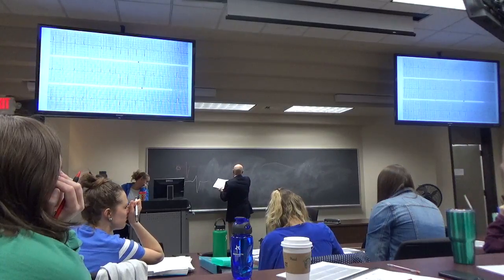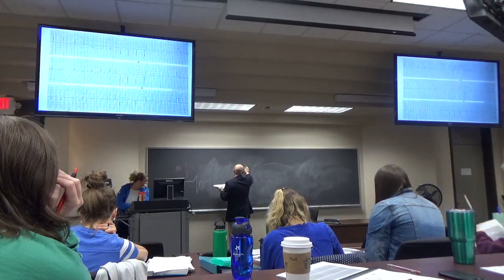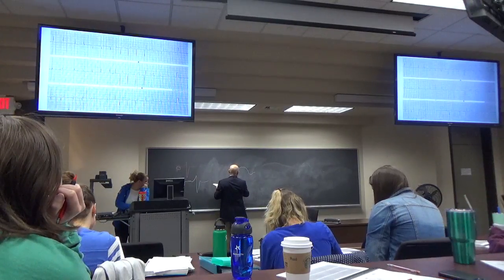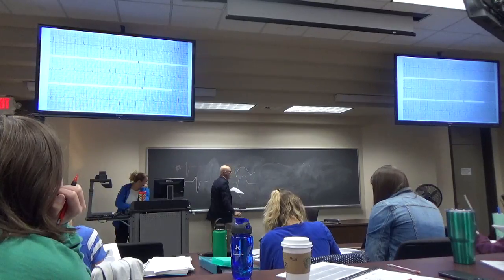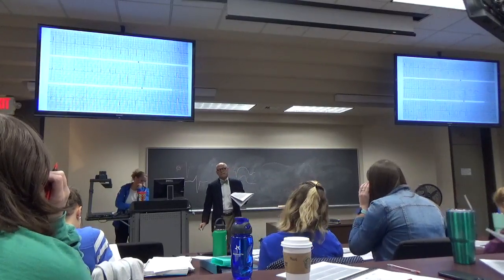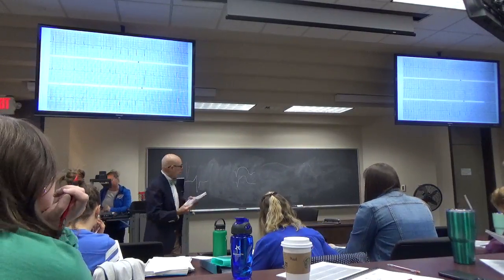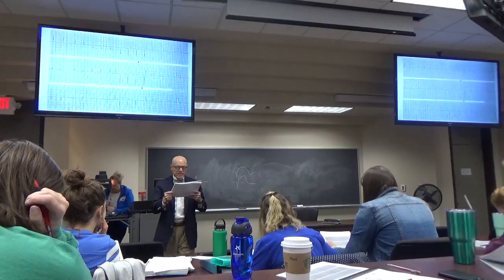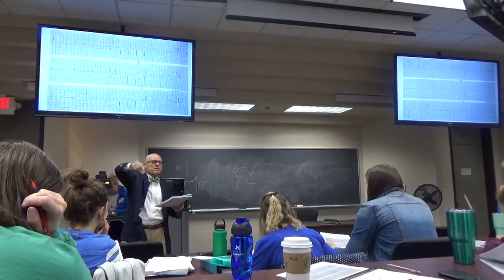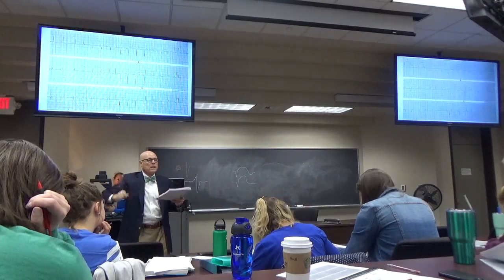So what I said initially was that this is an acute MI, right? Many authors will tell you now that that's an acute MI as well, because the ST segment is elevated. So why is what is happening in V1, V2, V3 old instead of acute? Okay, so the ST segment, if it's elevated, it's one box. I'm just not impressed. And the ST segment is concave and the T wave is upright. Okay, I see it. Does that make sense? I was seeing all the ones going up.